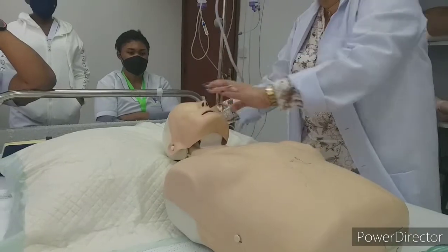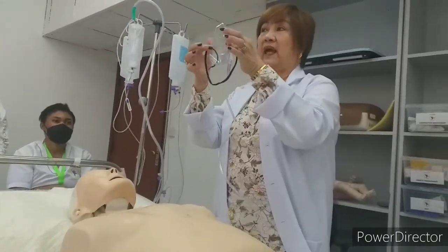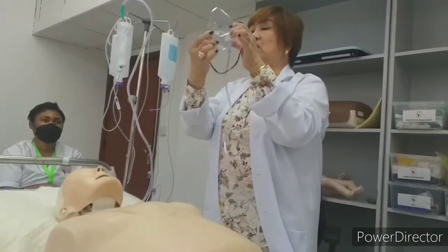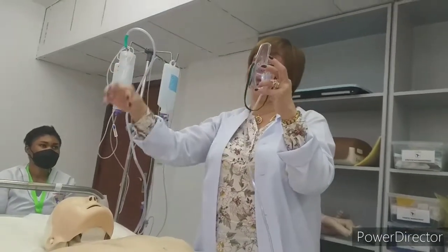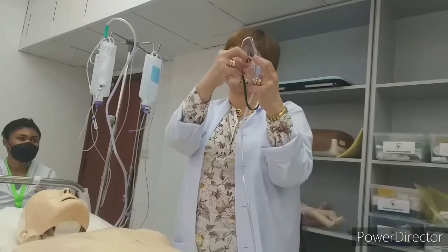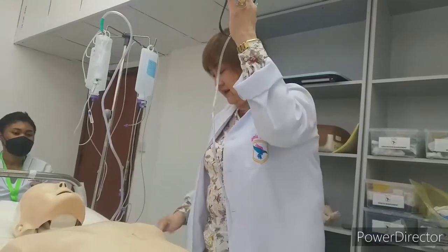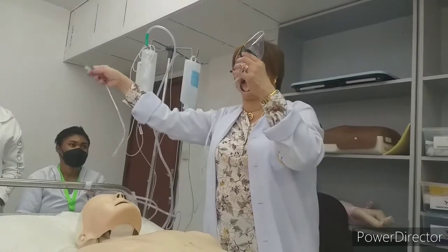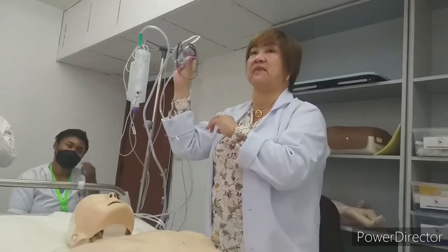Now, if the patient is asthmatic, we will be having a mask with nebulizer. Okay? That nebulizer has something like a cup in here. So the doctor will order some medicine to put in the cup. Okay? Same thing, we will be connecting 1 or 2, it depends, and how to test it, you do not put it here. Check for the mist.